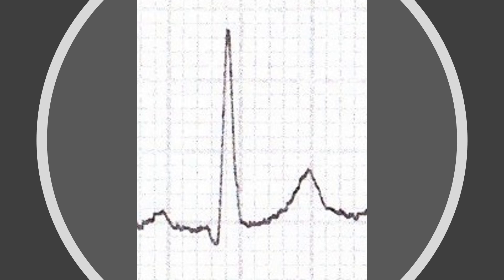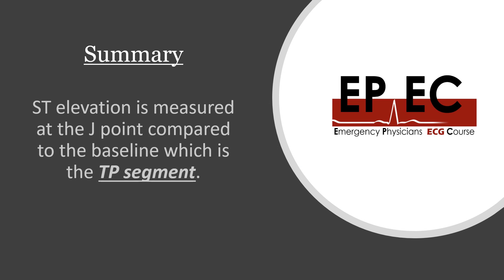If you apply this to the complex we've just seen, you'll find that this is your baseline, and you actually have an ST depression and a PR depression. If you use the PR segment as your baseline, you will incorrectly call this an ST elevation — and that is a significant clinical error you don't want to make. In summary, ST elevation is measured at the J point compared to the baseline, and the most important thing to remember is that the baseline is the TP segment, not the PR segment.